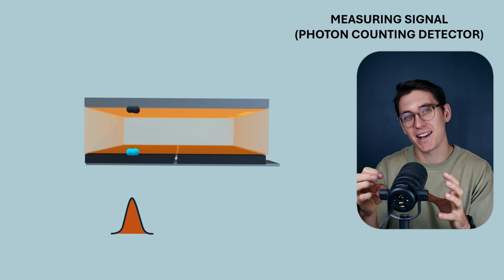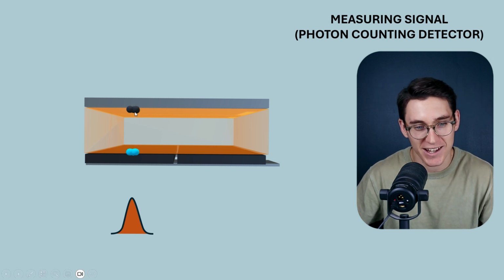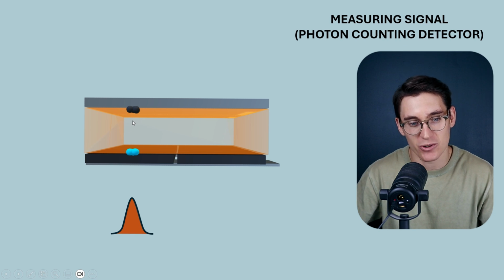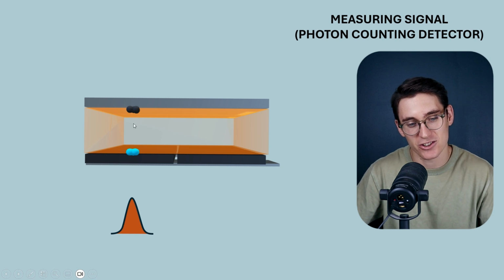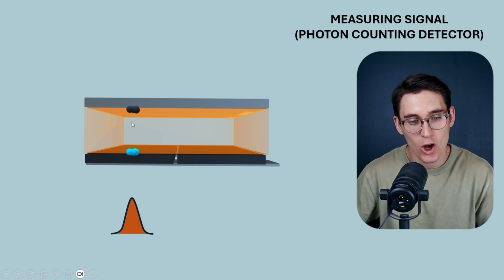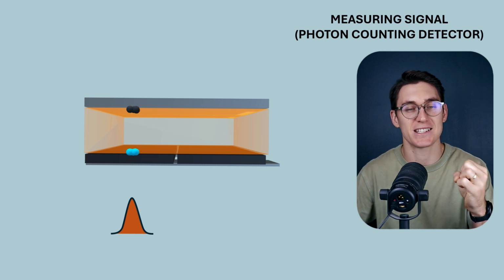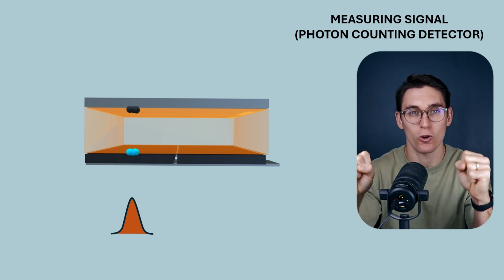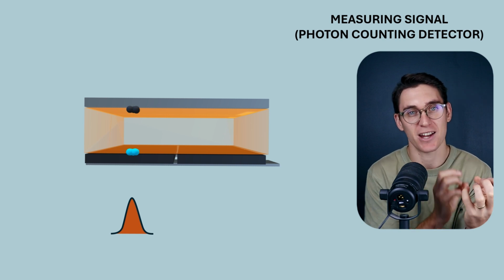Electrons in the conduction band then have the ability to move along an electrical bias, and we've created an electrical potential here between the cathode and the anode. So as that electron is released from the semiconductor layer, it's going to move towards the anode, along that electrical field. When the electron is released from the valence band, it leaves what's known as an electron hole. And the electron and the electron hole together is known as an electron hole pair.